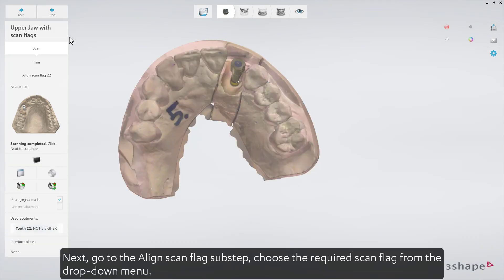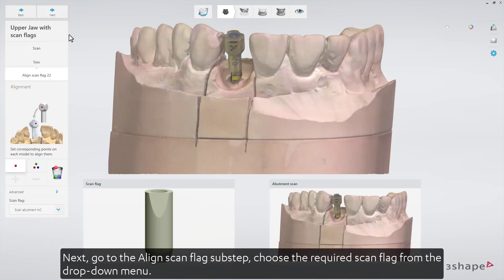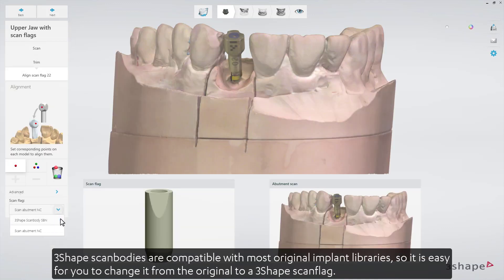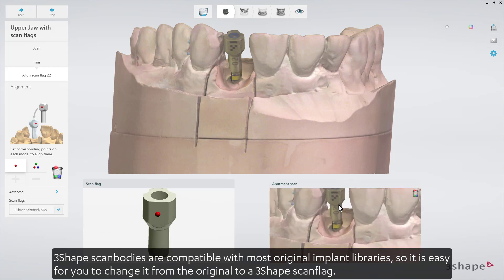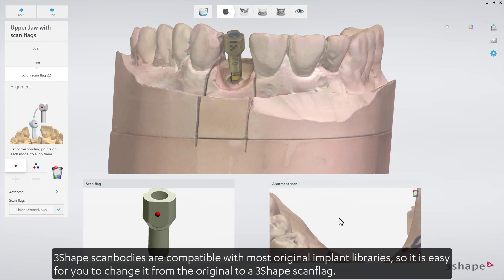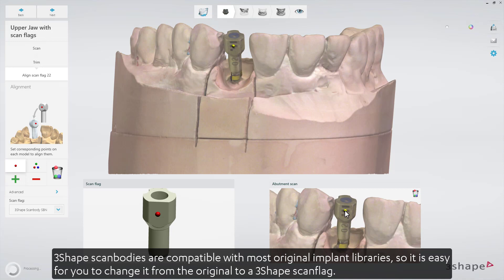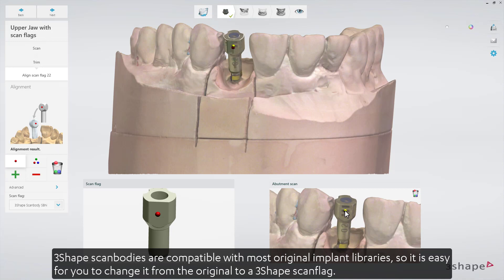Next, go to the align scan flag sub-step. Choose the required scan flag from the drop-down menu. 3-shape scan bodies are compatible with most original implant libraries, so it's easy to change from the original to a 3-shape scan flag.